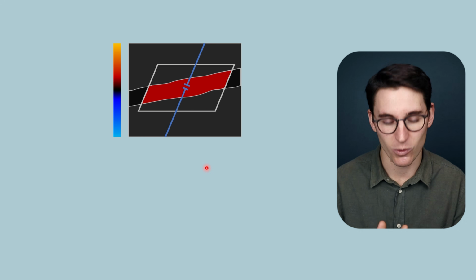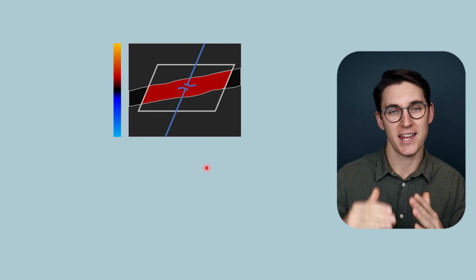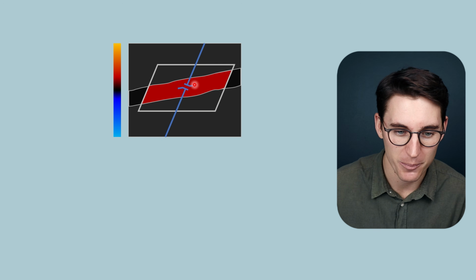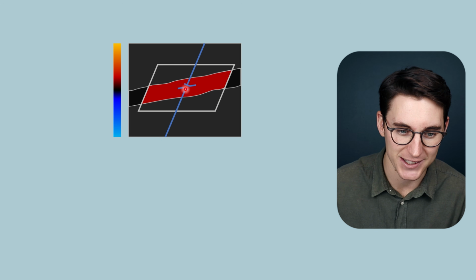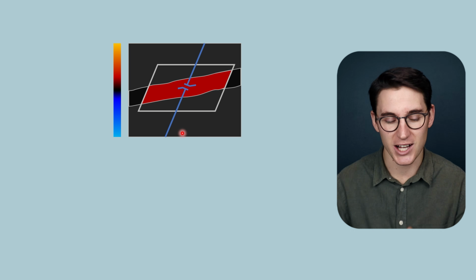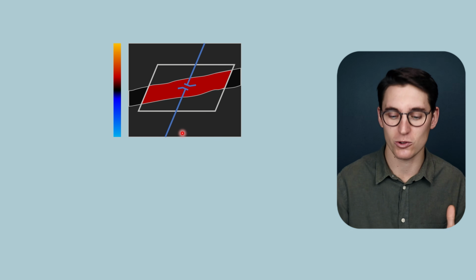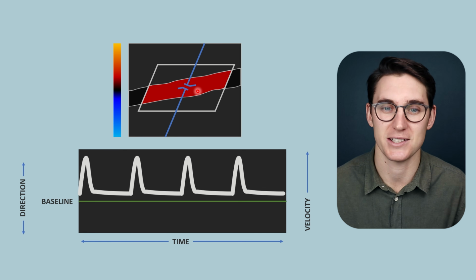Now, once we've placed the gate, we need to tell the machine what angle our A line is in comparison to our vessel of interest. And this setting of the angle means that we know what our Doppler angle is in the image. Now, this line, this angle calculation, needs to be parallel with the blood flow within a vessel. So now we've set up our pulse wave Doppler image, we can go about creating the spectral waveform that will form from blood moving between this gate here.